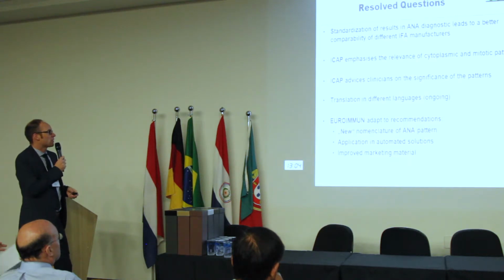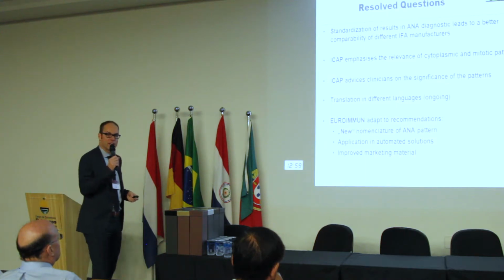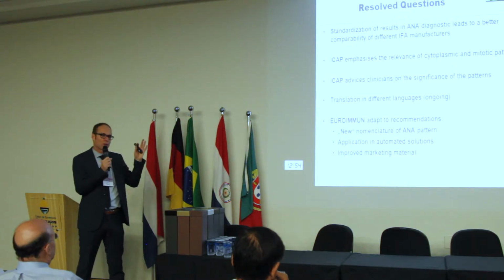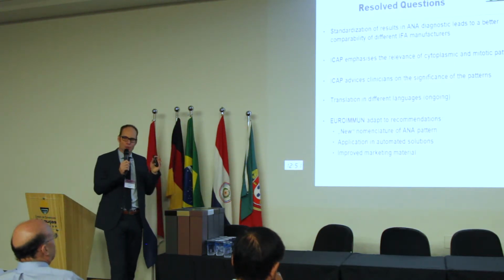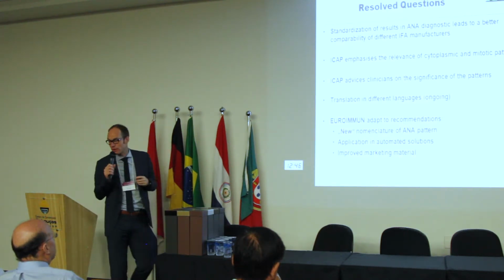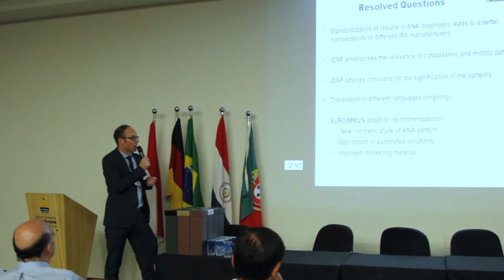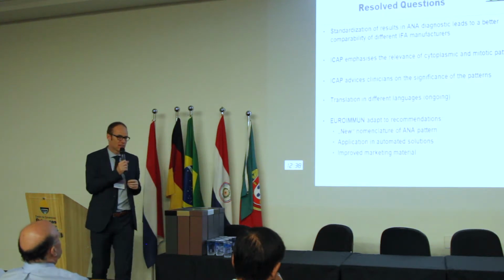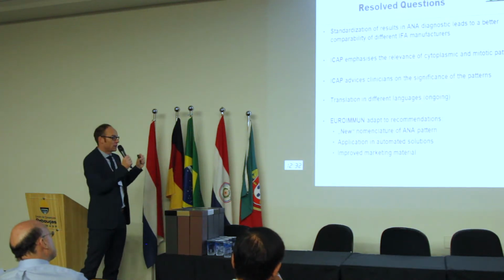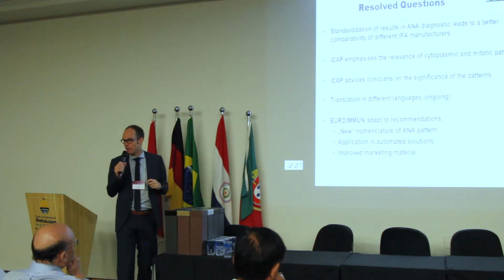I mentioned already the translation, that the translation is really important. So I mentioned the Japanese experience I had, and there are plenty of these things. So some call it speckled, some call it granular. What is nuclear dots? And now, because we have this still ongoing translation, but at least we have the most important languages done. Despite Chinese, I guess it's on the way. It's really an important issue that ICAP is taking this task of the translation, and I know that's not easy.